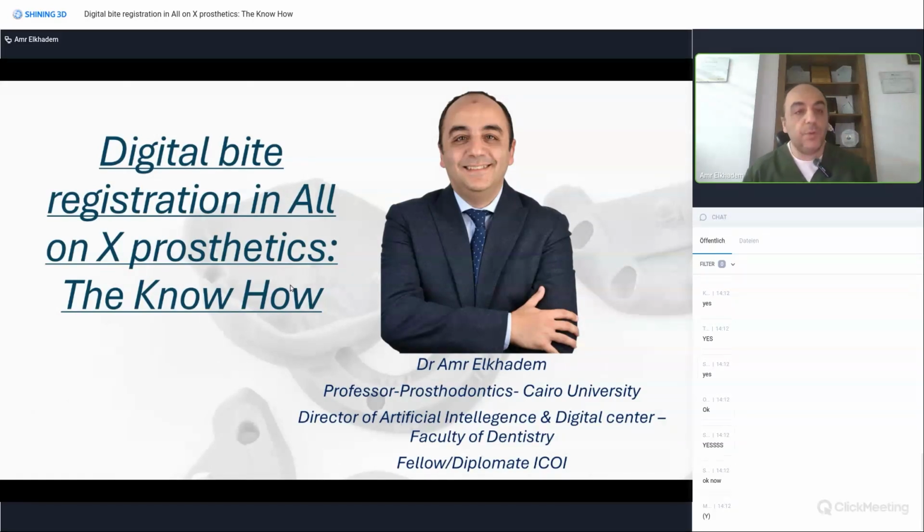I'll be talking with you today about the digital bite registration. The topic is a little bit tricky, because everyone doing conventional prosthetics knows that doing a bite registration for dentate patients is an easy job. We just follow the normal teeth. But when we are doing a bite or a jaw relationship for an edentulous patient, it's a little bit more tricky and more difficult. And when you go for the all-on-X, it becomes a little bit more challenging for everyone.